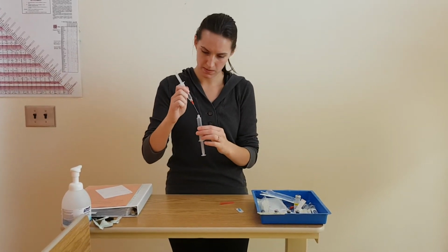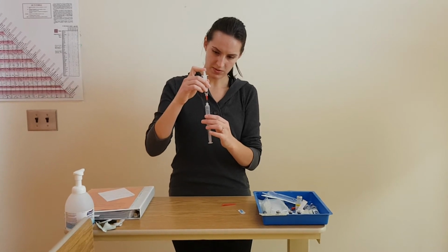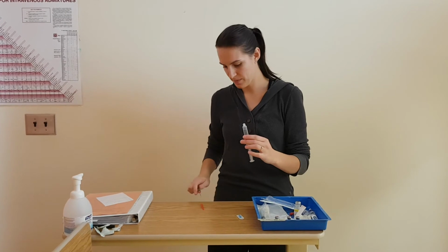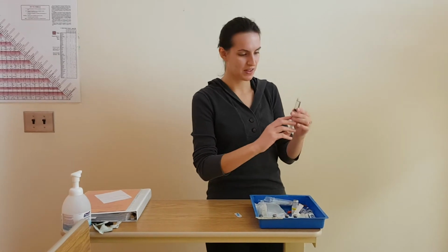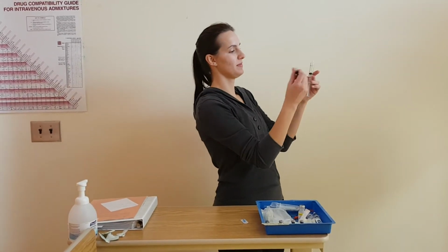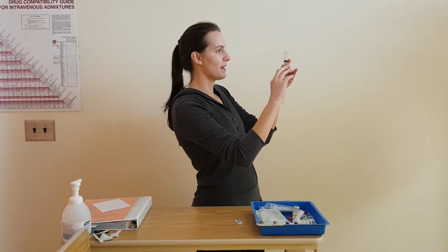So I have my vials here. I'm just going to swab them for 30 seconds, and then dry for 15. For the purpose of this video it is 30 seconds. Again, recap this using the scoop method, and this would be discarded in the sharps bin as well. So I'm going to get rid of any air bubbles in here, and I should have 5 milliliters by the end of it.